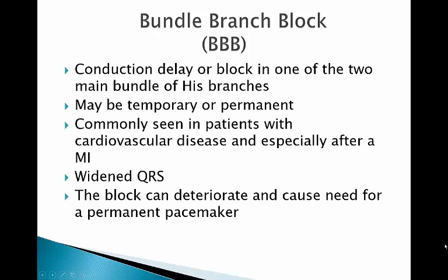Alrighty, so bundle branch block. Like I told you before when I showed you the picture of the 12-lead ECG, a bundle branch block is a conduction delay or a block in one of the main branches of the bundle of His. Usually it happens after an MI or with cardiovascular disease. Basically what happens, like I said, is when the electrical impulse goes down through the bundle of His, it's blocked. Something's blocking its way, and so then it has to reroute and go down another pathway.